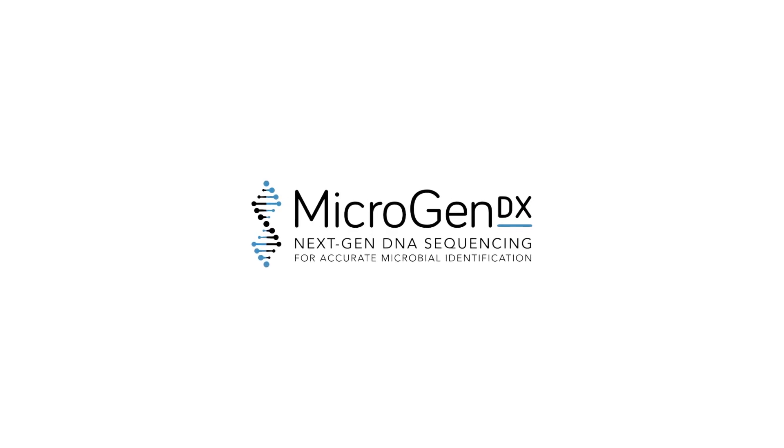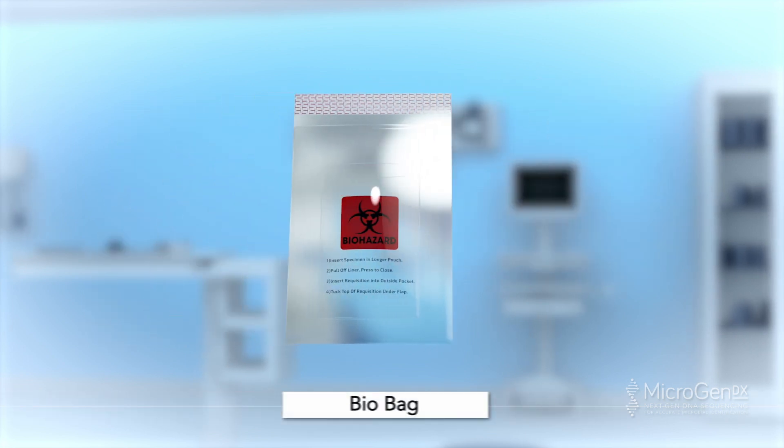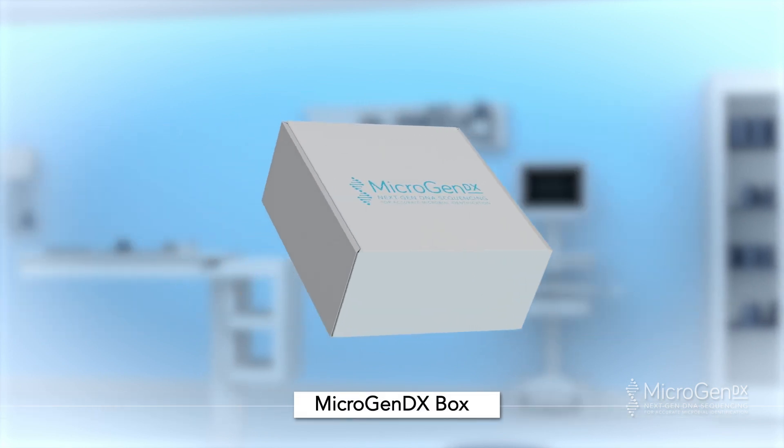MicrogenDX Collection Instructions: Urine Collection Method. The MicrogenDX Collection Kit will include one 90-milliliter collection cup, a bio bag, a lab requisition form, and a MicrogenDX box.